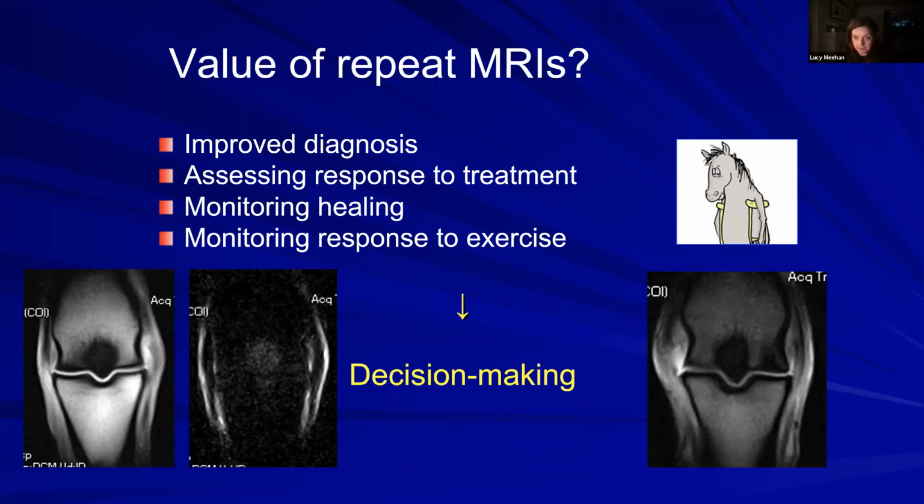Certainly I've had that experience where I've tried to do limited sequences and spotted something in the corner and gone, well, actually now I need to do more. And certainly I think it's very easy to overlook new pathology if we're only doing limited sequences.